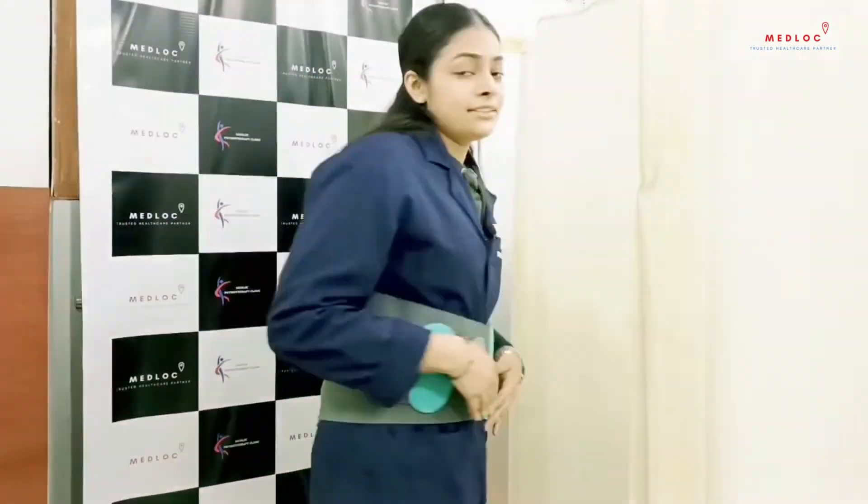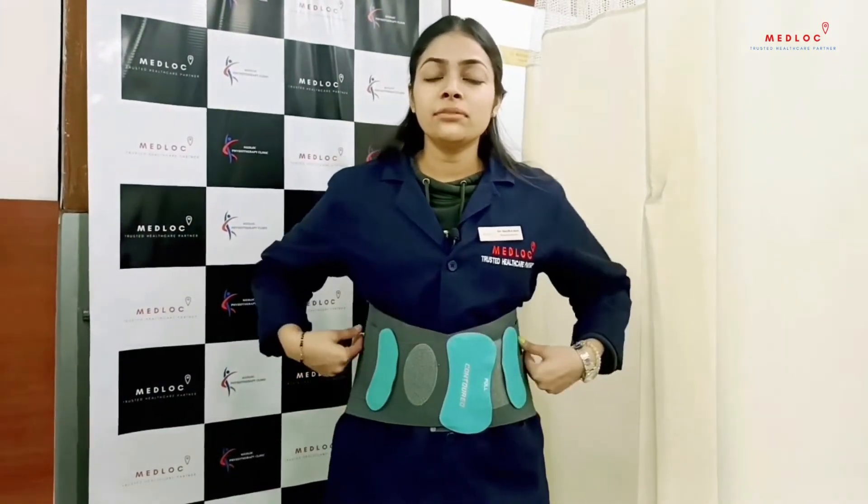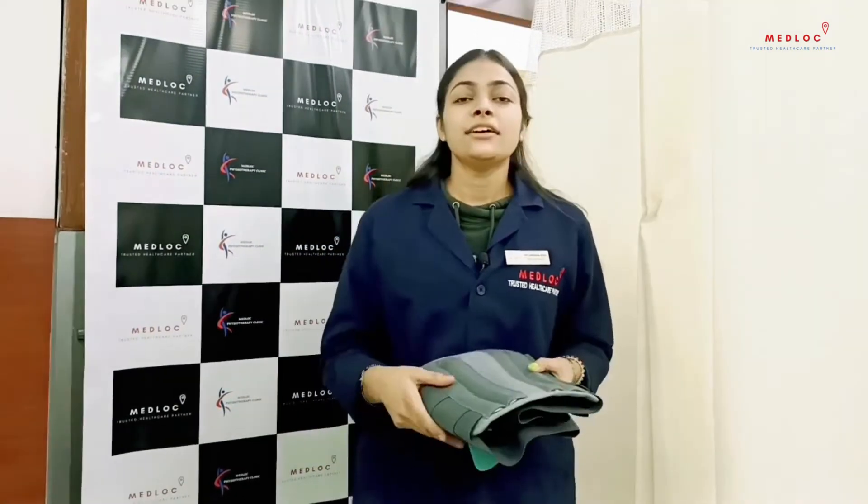You can wear it while sitting, while working, while doing any strenuous activities, or while travelling. It will give proper support to your back and will help you with posture correction.